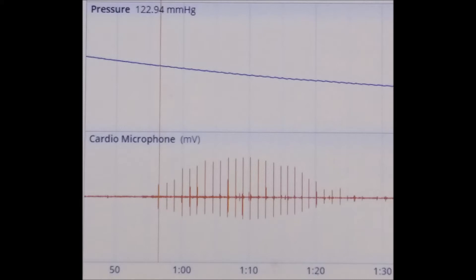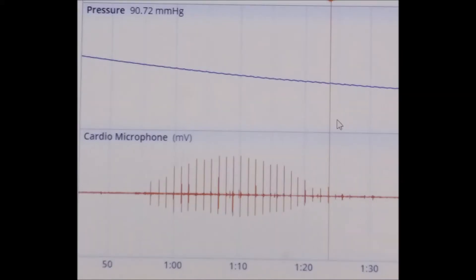Calculate the systolic pressure by placing your marker tool at the first sounds of Korotkoff. Then follow the vertical line up and find the corresponding pressure. Follow the same procedure using the last sound of Korotkoff to find the diastolic pressure.